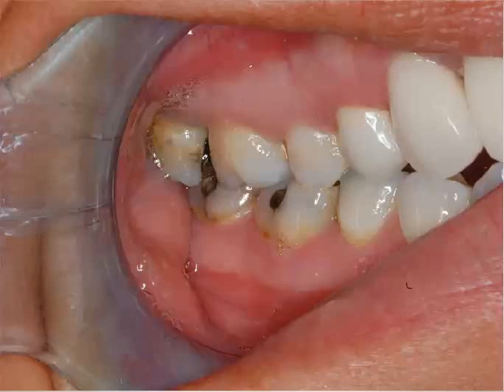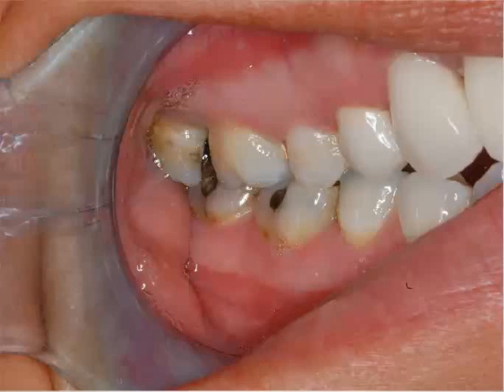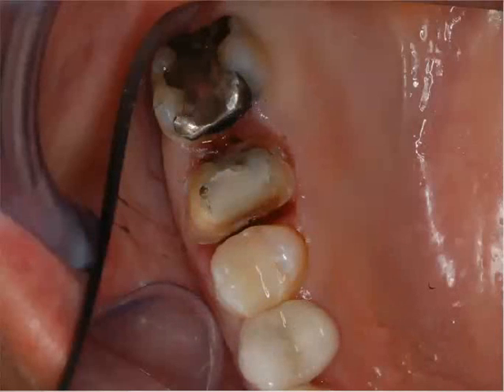We're going to be placing crowns on teeth number 3 and number 30. You'll see there we're doing CAD/CAM restorations. Let me go back to that just to show that again. We're putting crowns on tooth number 3 and number 30. Tooth number 3, once we look from the occlusal, she had minor symptoms from cold, recurrent caries, breakdown, and microleakage of the amalgam. We know we're replacing that with some type of base, and I'll show you how that's accomplished.